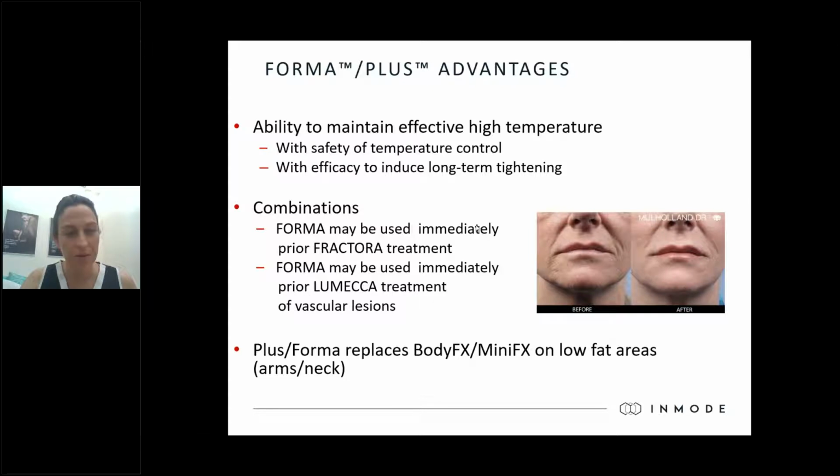Do we work in single mode in any specific situation, or do we always have to be on repeat mode? I recommend to always work on repeat mode. The repeat mode enables us to work continuously. The single mode requires you to repress the foot pedal again and again every 30 seconds, and this is just more laborious for you and makes no sense. It's there for historical reasons. You can ignore it now. So work on continuous mode always.